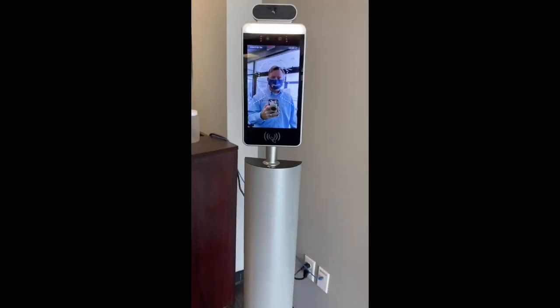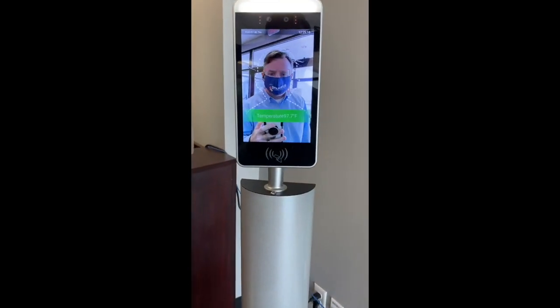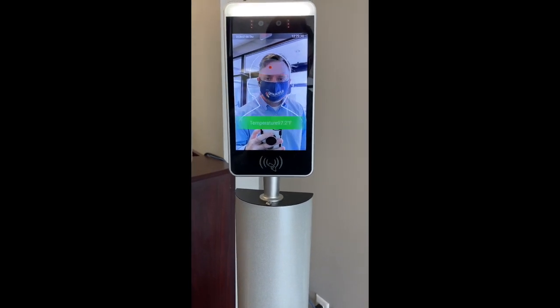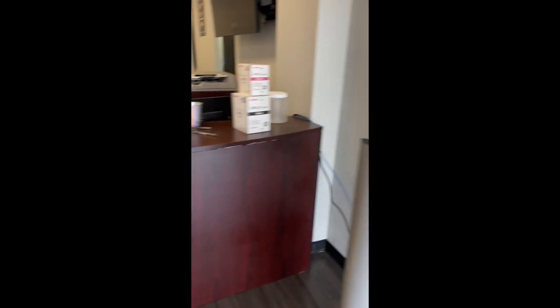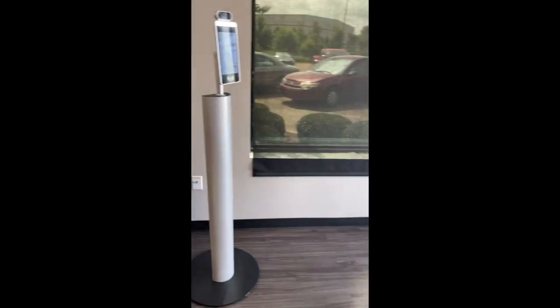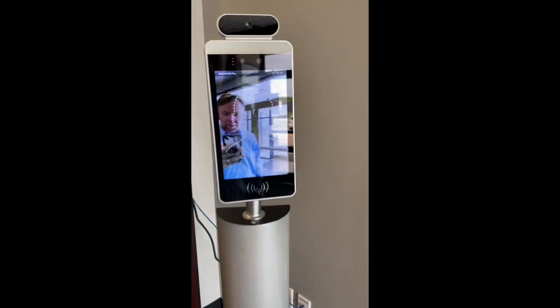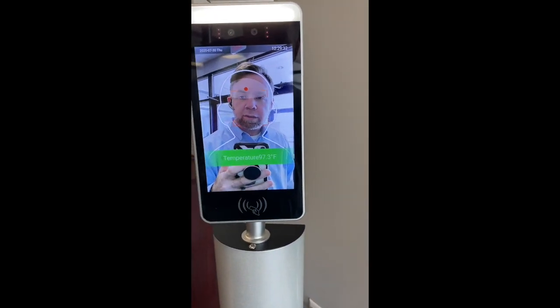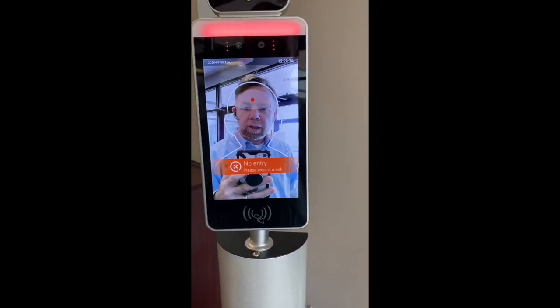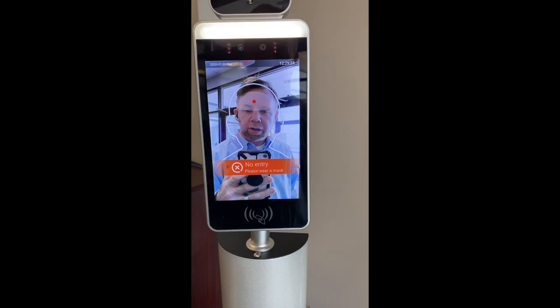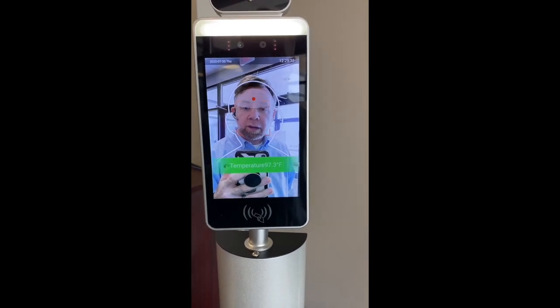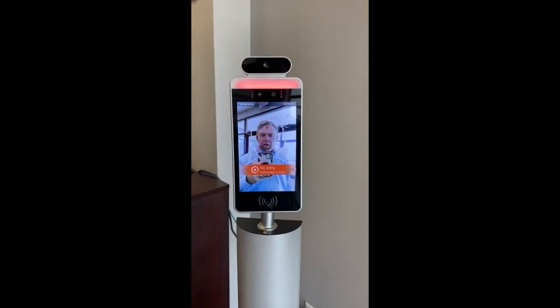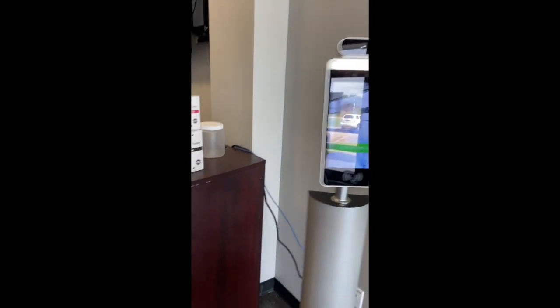What I want to show you today is an automated temperature scan — it gives me the readout. I'm going to step away and take off my mask as I come up here without a mask. Normal temperature. Please wear a mask. I still get a temperature scan showing normal temperature, but I get the prompt: please wear a mask.